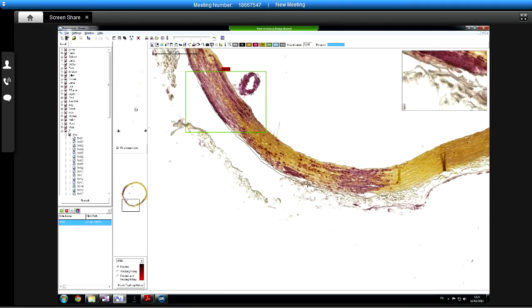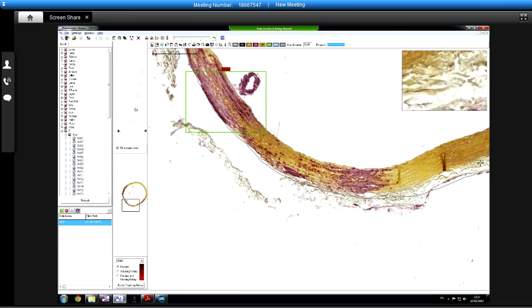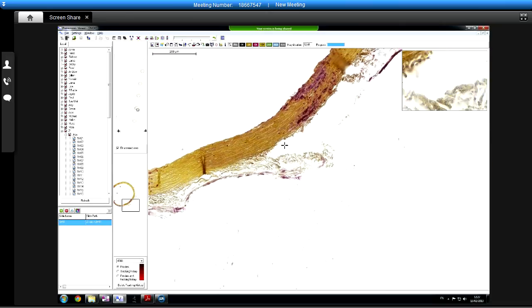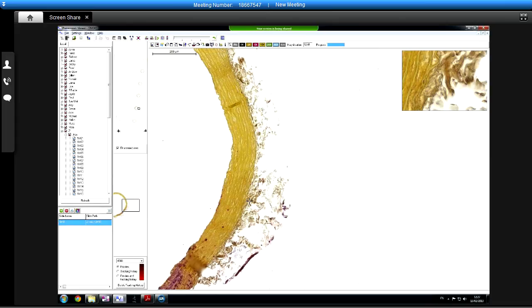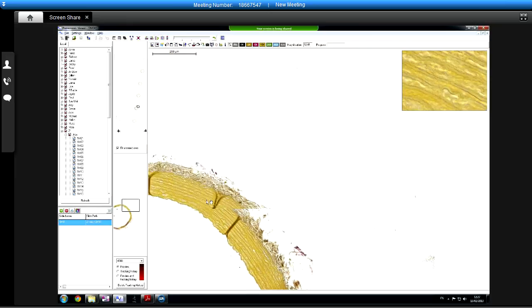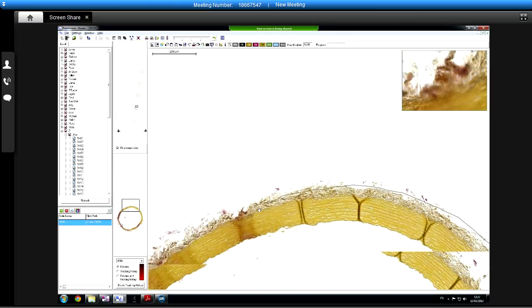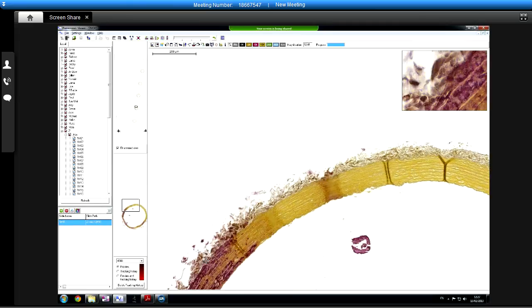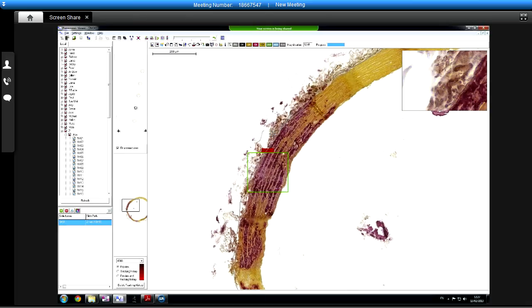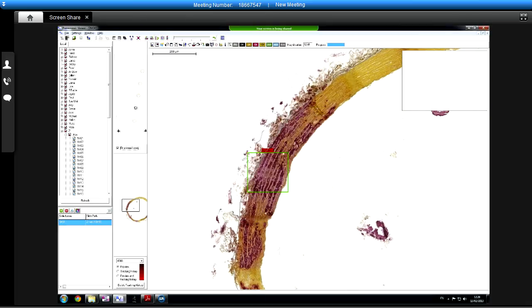Don't worry too much about how accurate I'm doing. Just want to see roughly what it does for now. I'd be quite happy just to get a result. Okay, so at the moment it's going to measure the stuff in the middle. Let's worry about that later.